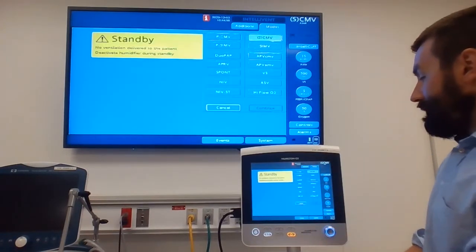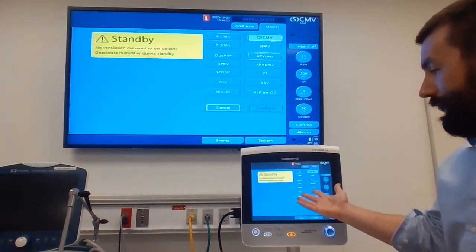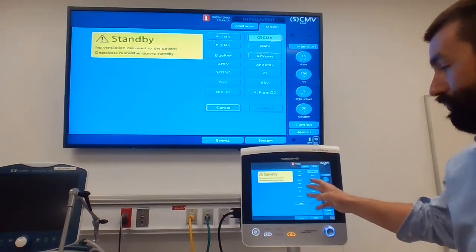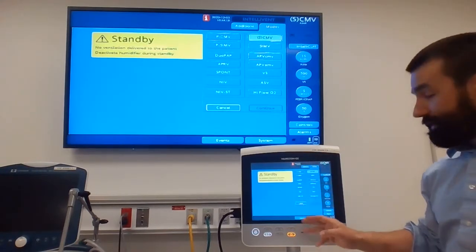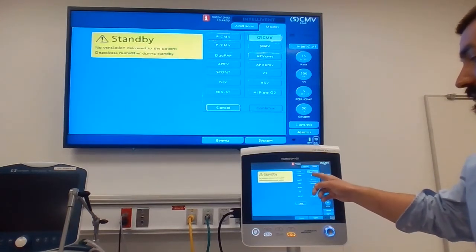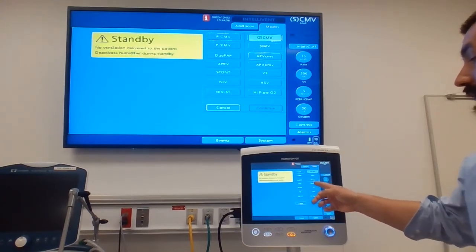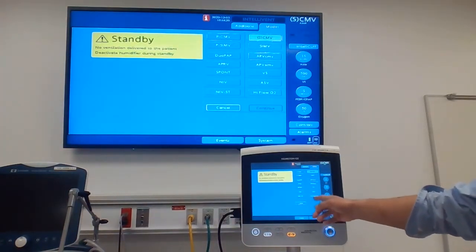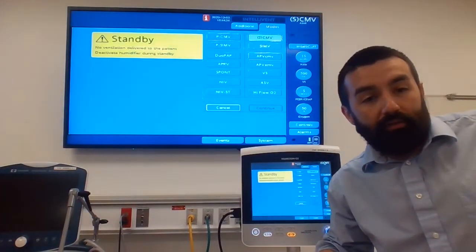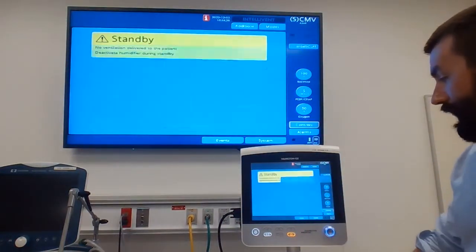I'm going to show you again, remember on the Hamilton ventilators, it segregates all your modes. So you have all of your true pressure type ventilation on the left-hand side of the mode screens. On the upper right, you have your traditional volume type ventilation. And then you have your volume targeted pressure type modes, and ASV is really using that format. So your PRVC and something called volume supported, we'll talk about a little bit. So I'm going to choose ASV. I'm going to hit continue.